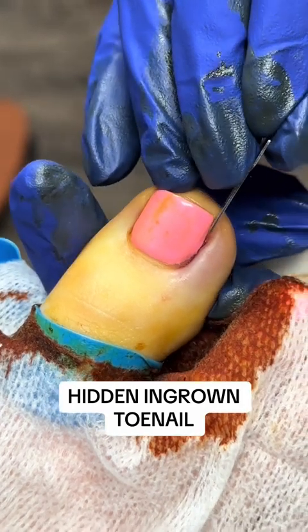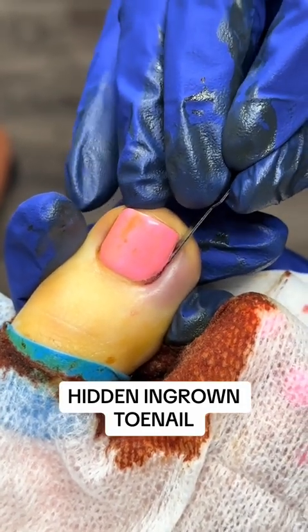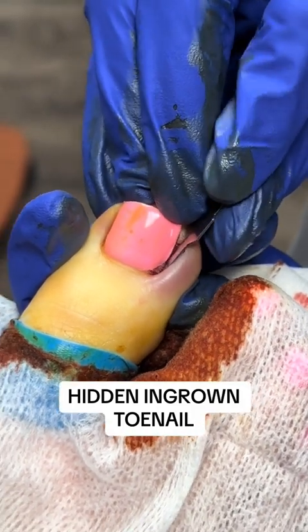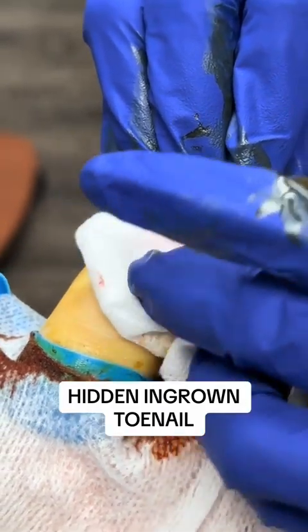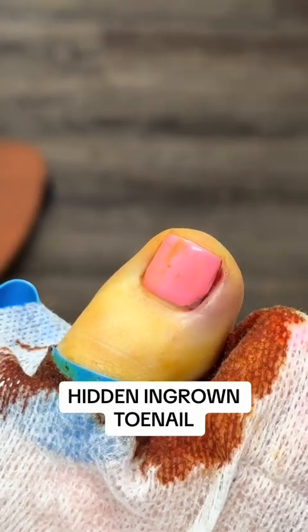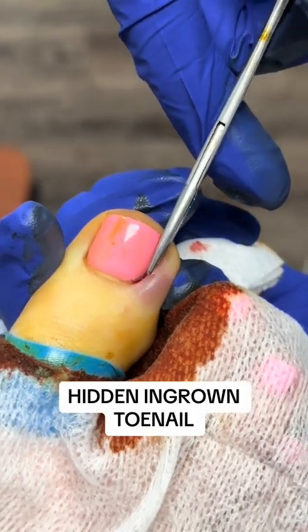All right, so, and I think it also helped that she has had an ingrown taken out before. So I'm just gonna follow this. I don't wanna make this any more narrow because this part looks good, I like that. But we know where there's nail back there, so I'm just gonna follow that back there. It's likely gonna be a thinner sliver, not a big old piece of nail, but let's see. I've been surprised before. We'll see how much nail we have there.